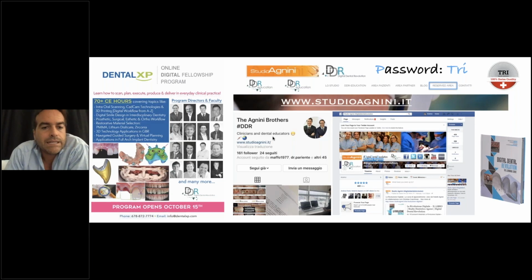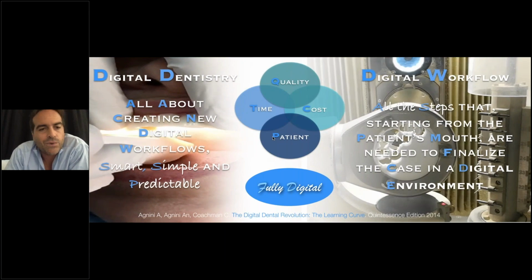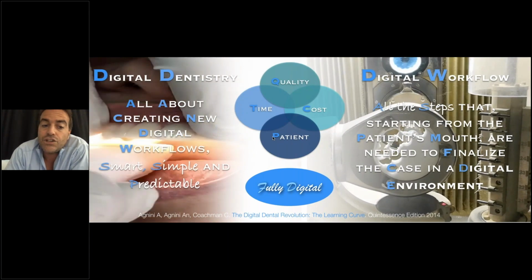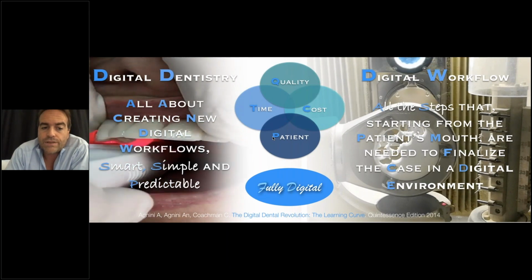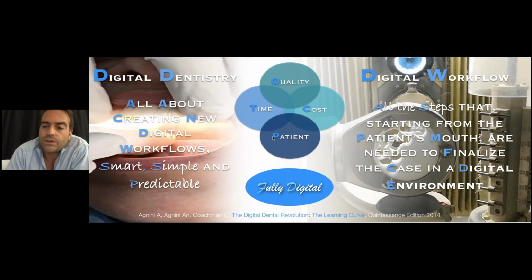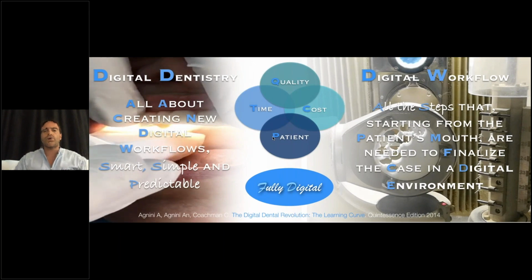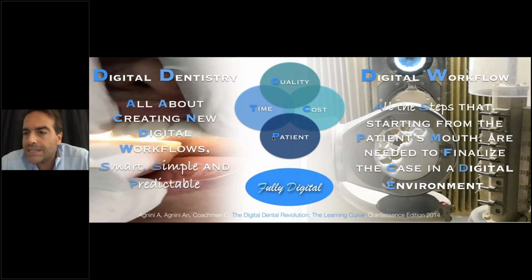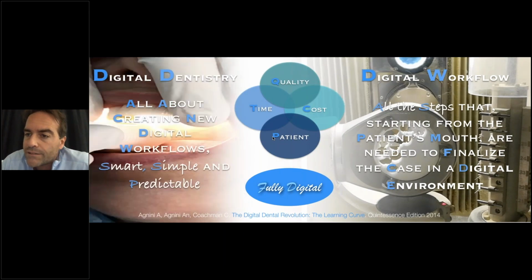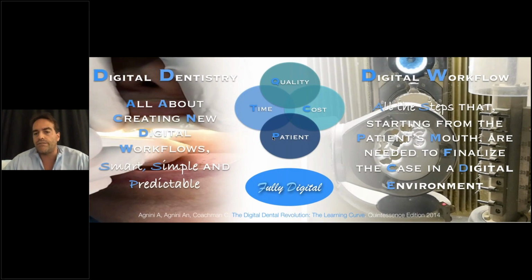But entering immediately into the topic, we are discussing digital dentistry, but to start, we need to define what digital dentistry is all about, which is basically creating new digital workflows, which should simplify, should be smart, and should create more predictable restorations. They should basically simplify our life. And what is a digital workflow? Basically, a digital workflow is the summary of all the steps that, starting from the patient's mouth, are needed to finalize the case in a digital environment.